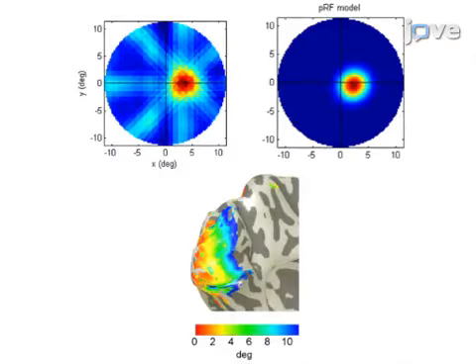Ultimately, application of a proposed method to model fMRI signal response to visual stimulus yields the topography of visual population receptive field and its model. The main advantage of this method over existing methods like direct fitting method is that our method does not require any prior pRF model chosen.